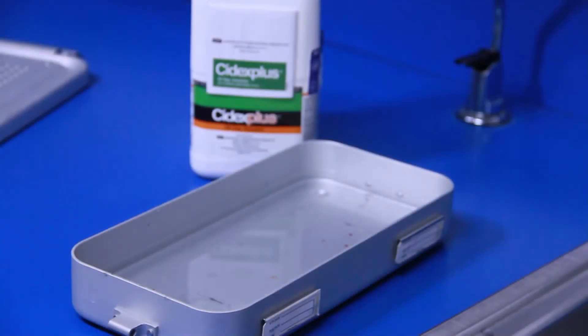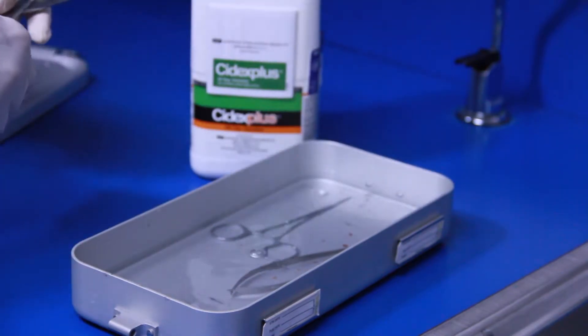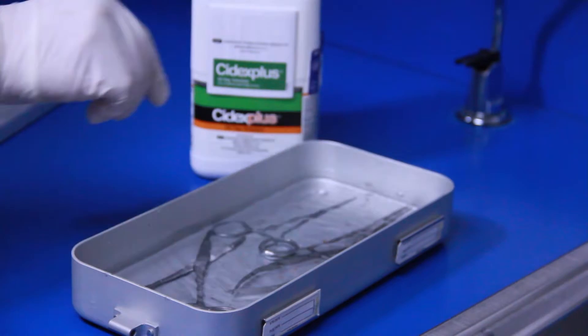Cold sterilization involves soaking instruments in a cold sterilant like Cydex for at least 10 hours. This process may be detrimental to fine instruments.